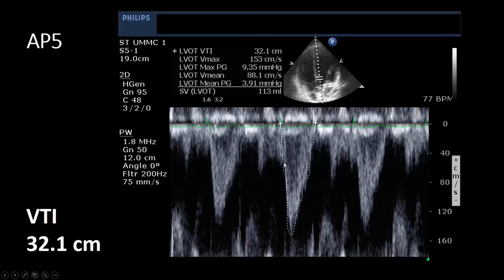It's best if it's got this sort of white outer rim and this nice laminar flow inside. And again, you're going to find your baseline by kind of trailing down along this outer edge of the envelope on both sides. Or if you have an ECG hooked up and you're a nerd, look at how beautifully displayed this is. Middle of the QRS to end of the T is systole. That's how you find the baseline.